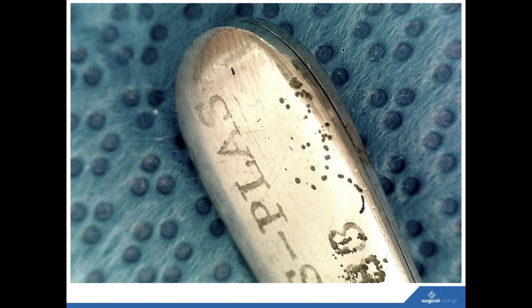It's unfortunate, but we see a lot of this in sets that we inspect and go through as we're evaluating instrumentation. When instruments are like this, we talk about refurbishment, but there's nothing that can be done to rescue that. I think the whole thing is compromised. Giving it to the repair company is going to be a waste of time, so you've got to make that decision, educating yourself and becoming familiar with this sort of pattern on an instrument. You could show it to them, but for sure, in this case, it's this far gone, there's no rescuing the device. It would need replacing. Absolutely.